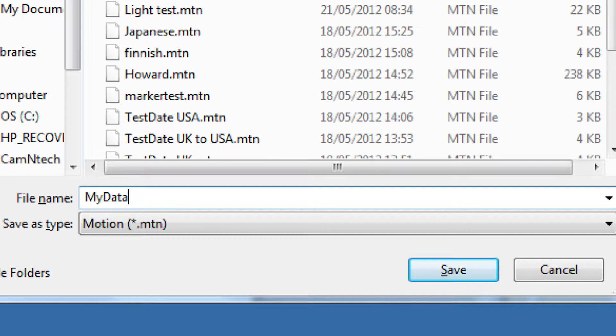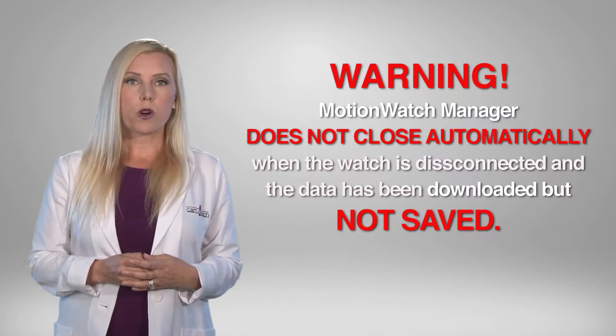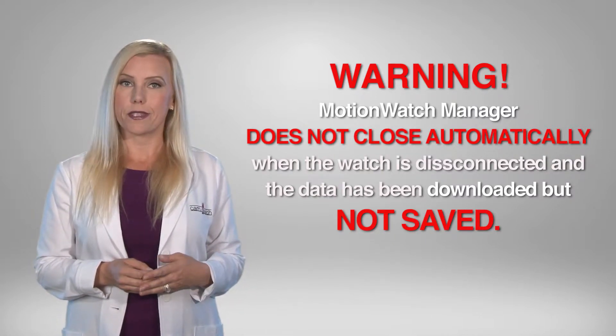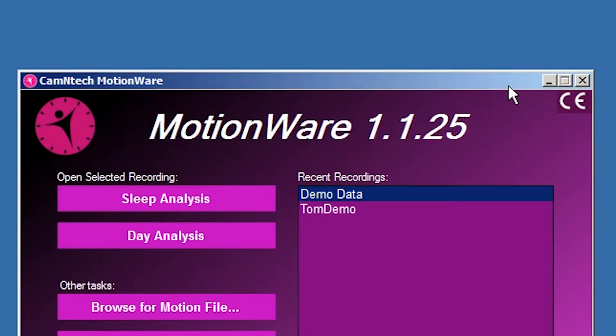If you do not wish to save the file, click the Cancel button to return to the MotionWatch Manager. Remember that the MotionWatch Manager will not automatically close when the MotionWatch is disconnected if data has been downloaded and not saved. This serves as a reminder to save the data. You may manually close the window if the data is not required.